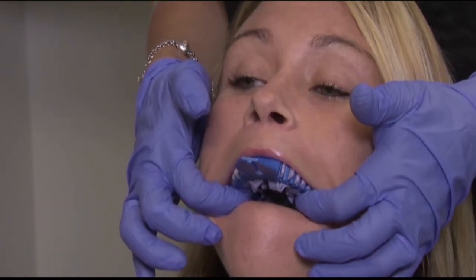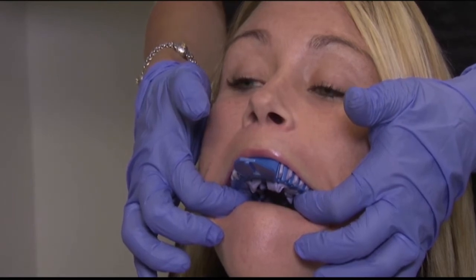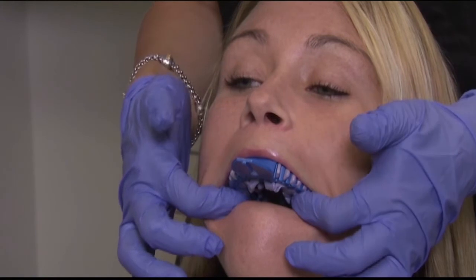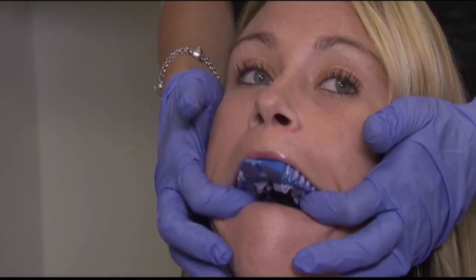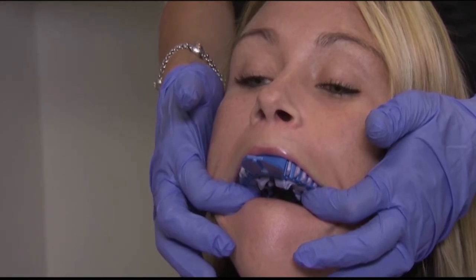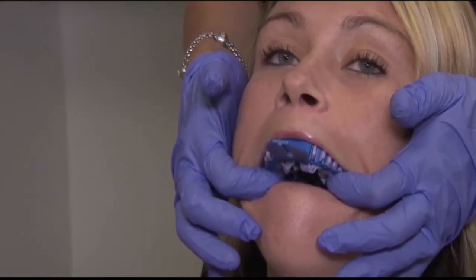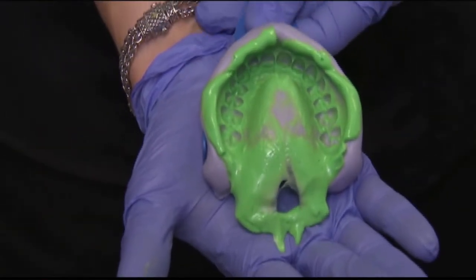I love this technique. There are a lot of different techniques out there. There's one called the one step, which we have a video of on YouTube as well, where you can make a trough and then just add the light body in it. But this one I like because if I take the impression of the putty and for some reason I didn't have enough material or the tray was too small, I can stop right there. But if I add that light body to it, it's first of all a lot of waste of material if it's bad, and most importantly, I might not capture everything, and I can stop.